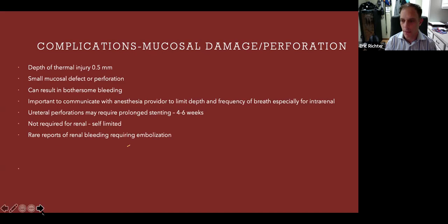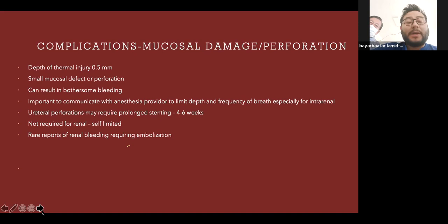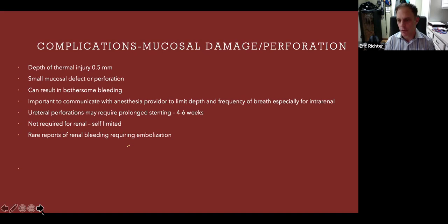Okay, that's right. Here in Mongolia, we mostly perform with the spinal anesthesia for the patients. But I think now we need to change the anesthesia into the general one while we will use the laser technology, right? I think for intrarenal stones, yes. For ureteral stones, I don't think it's as important. Because with ureteral stones, you don't get nearly as much movement. So if the patient will lie still... where I've done most of my workshops in Uganda, they don't have many stones, but I'm used to them doing cases under spinal anesthesia, which we wouldn't do in the United States, but the patient and the staff are comfortable with it.